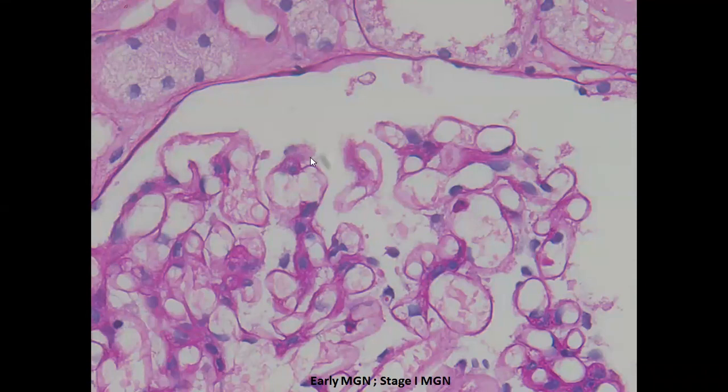Normally you don't get to see podocytes so evidently. Here, this is a parietal epithelial cell nucleus, and this is a podocyte lying just outside the glomerular capillary loop. If there is lifting or prominence of podocytes, that can happen in membranous glomerulonephritis because of the subepithelial deposits. It causes lifting of the podocytes, and they start appearing slightly more prominent on routine light microscopy. But prominence of podocytes per se doesn't mean we are dealing with membranous. You need to do immunofluorescence to demonstrate that there are immune deposits along the glomerular capillary wall.